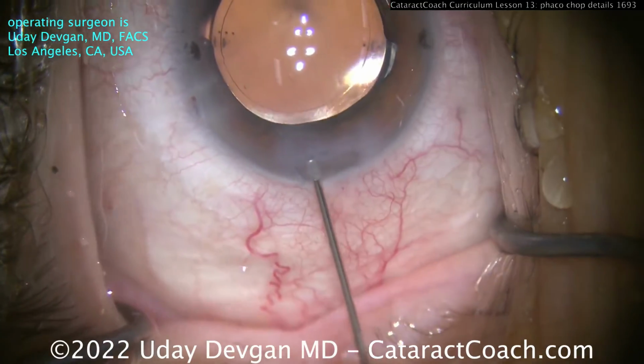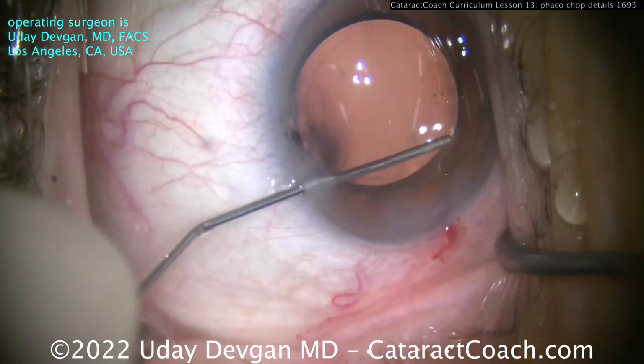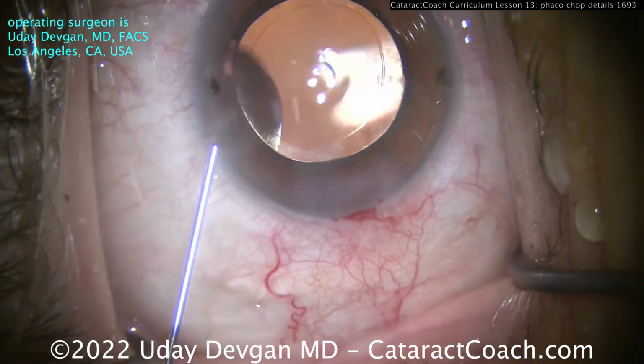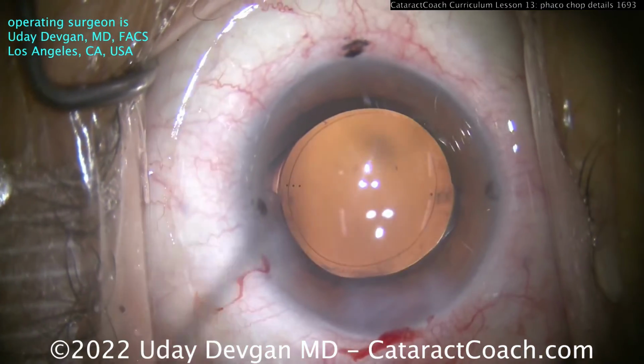Very slight hydration of the main incision. You don't need a whole lot of it. Next, look how the rexus overlaps and captures the optic. So for sure, that's about a 5mm capsule rexus. And again, judging by the optic size at 6, you can see it's a beautiful overlap for 360. So everything here looks pretty good.